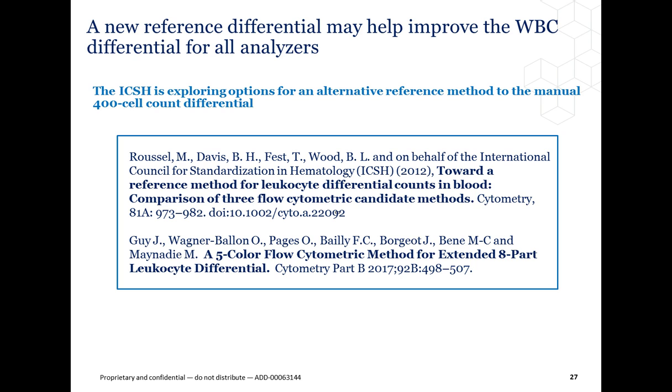And the aspect of the cost of monoclonal antibody testing was realized, and the use of those technologies was limited to special testing for advanced disease detection and identification, and still is today. However, if we had a reference set of monoclonal antibody methods that could be developed, this would provide manufacturers and researchers the reproducible, confirmed, ground truth cell classification for improving their respective technologies and subsequent algorithm development.